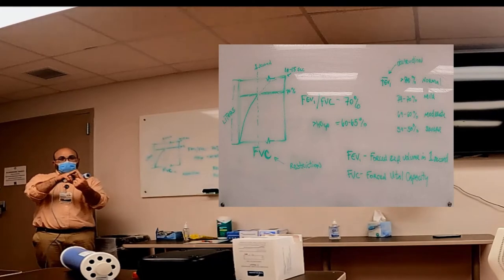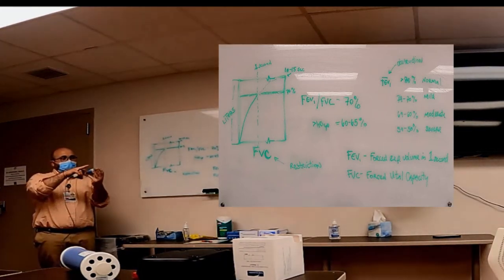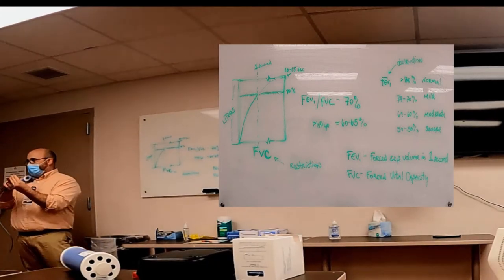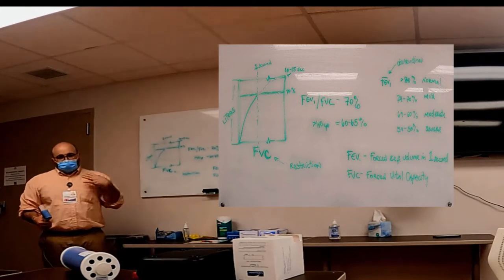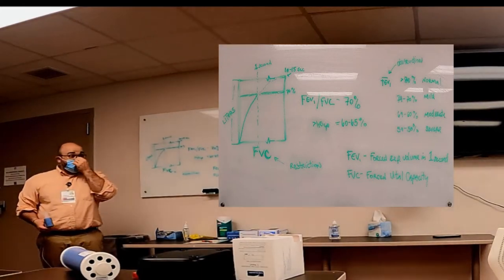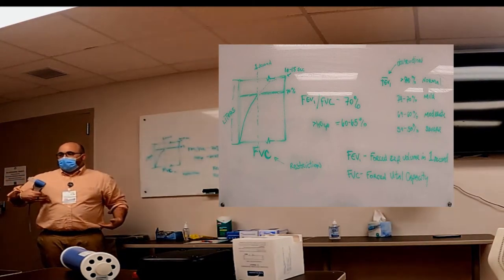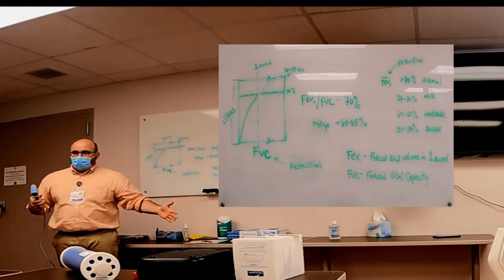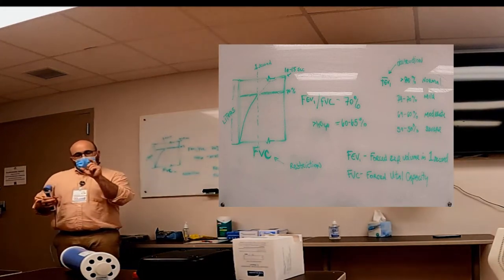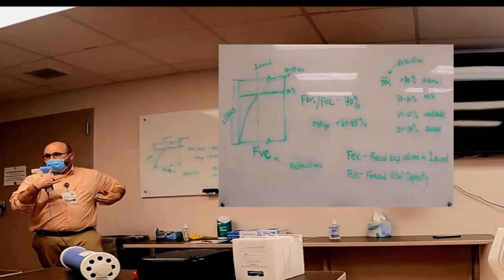Male or female, height, and age. Now, weight's not calculated in there, right? I'm a towering 5'5", so it wouldn't matter if I was 5'5", 120 pounds, or 5'5", and 320. My thoracic cavity is the same size. So if there is a 5'5" woman, same age as me, next to me, my predicted would be just a smidge higher, just because males are built with a little wider chest cavity.